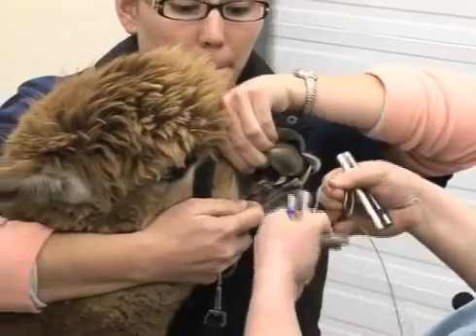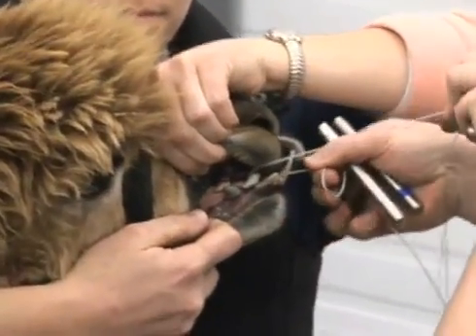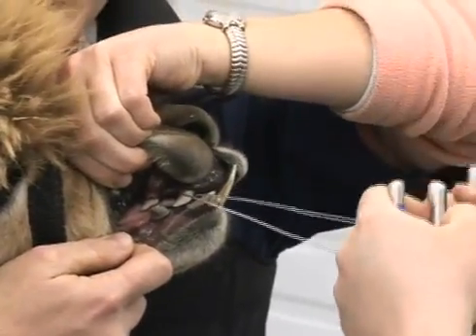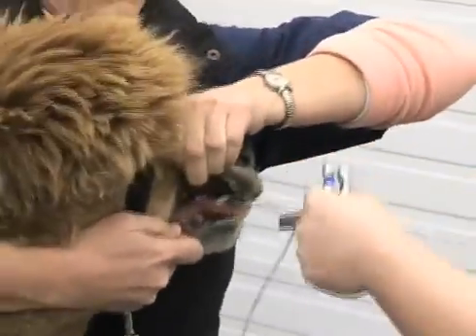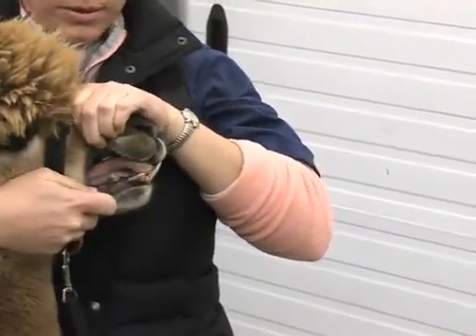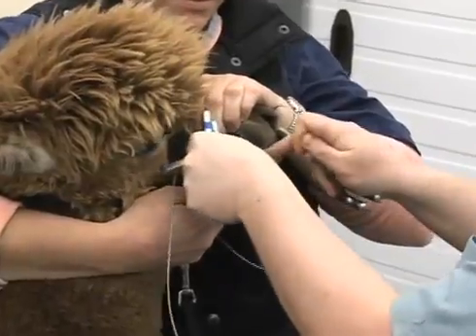Now that we have our teeth exposed, we place our wire back behind the hook of the tooth, keeping a little bit of tension to hold it in place. We go up as proximal as we can — as close to the gum line as possible — and then use steady, even pressure back and forth. Eventually the tooth will just kind of pop out. Then you can move on to the next tooth.